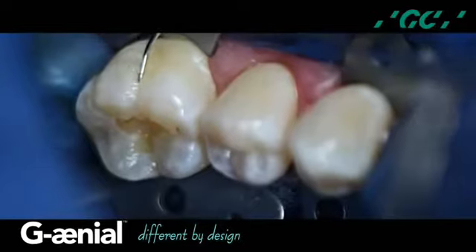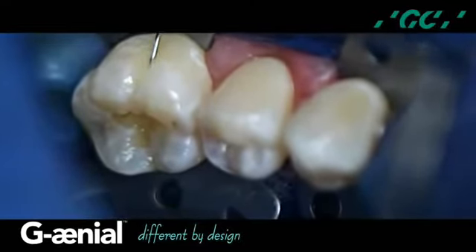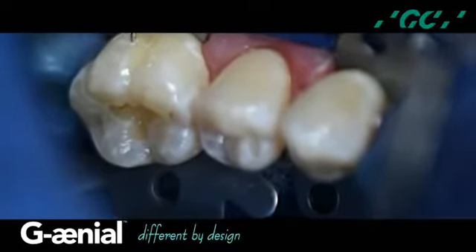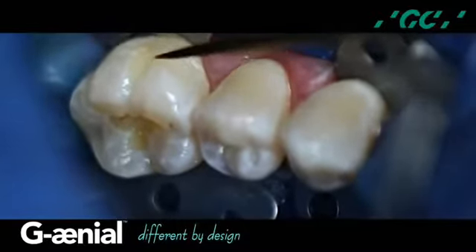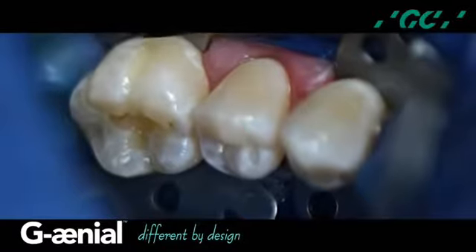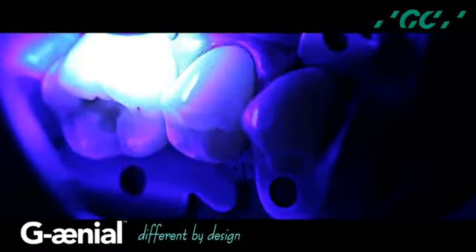I continue to adapt the material using the fine tip of the 1112 Explorer. Notice I develop the anatomical morphological contours. I use a double-aught sable brush to adapt the material to the Cavo surface margin and an 1112 Explorer by Ufridi and light cure for 10 seconds.